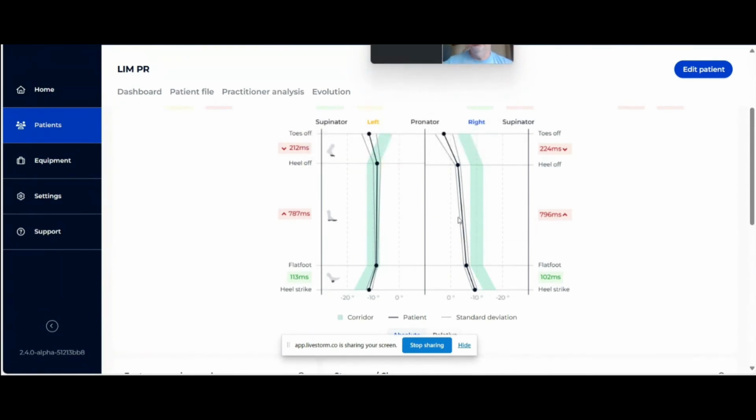And again, that's also consistent with what we were talking about earlier, is that propulsion is going to be affected, or toe off, because of typically strength. So at least at this phase, she's also engaging her hip flexors to go into that propulsion because it showed that they were in really good ratio. But what you do see is there's a decrease in that particular time course.